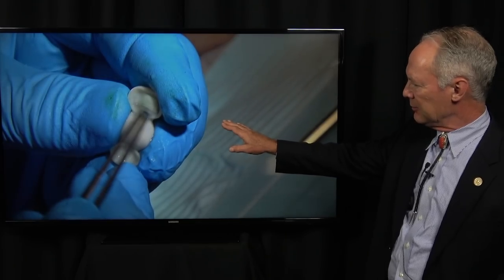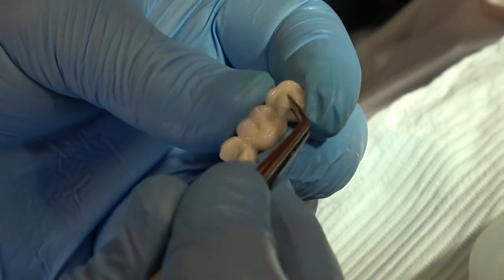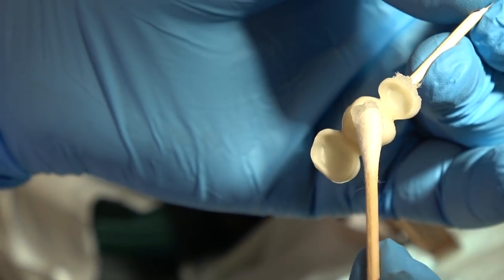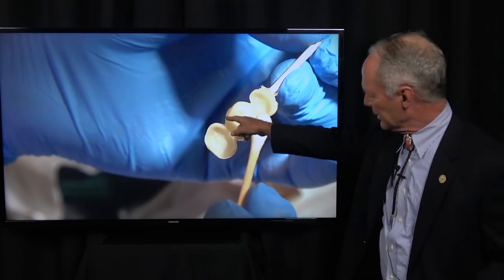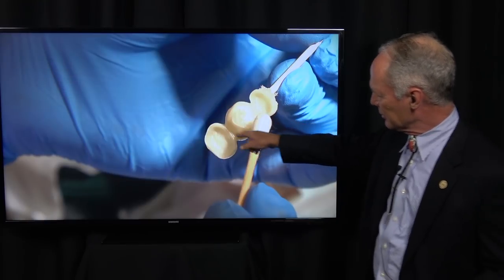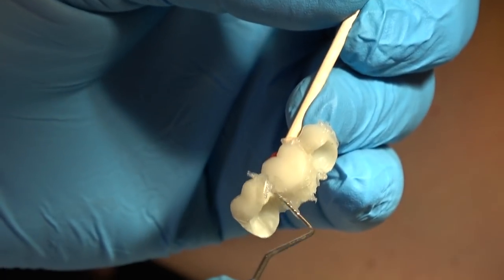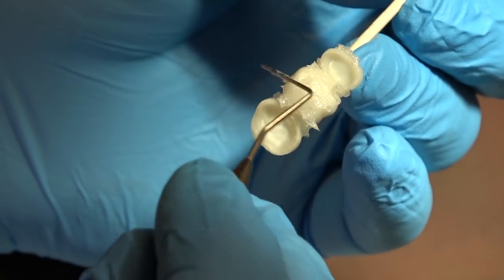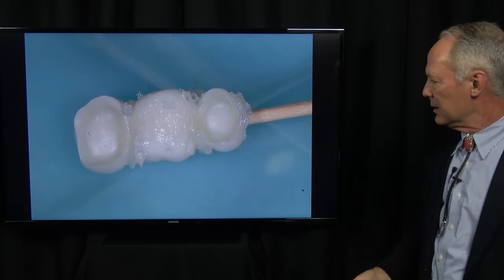The zirconium's already been treated with Z-prime, and we're going to clean it with isopropyl alcohol once we've tried it in — just clean it real well. Then place Vaseline in the interproximal area, on the gingival aspect of the pontic, and in the embrasure spaces on the gingival side so it'll be easier to remove the excess cement. Place Vaseline all along the underside of the pontic and in the embrasure spaces.